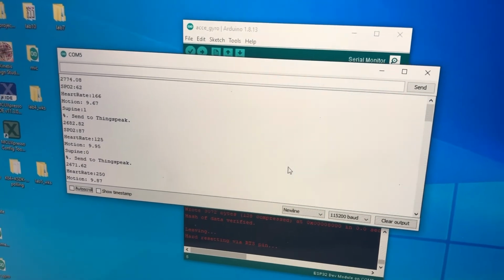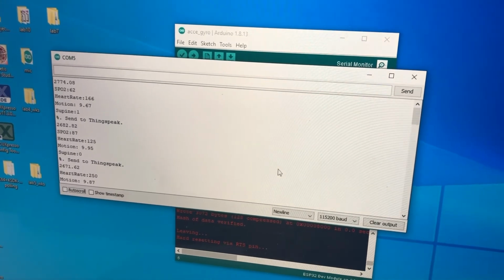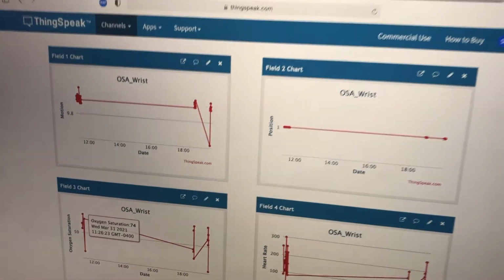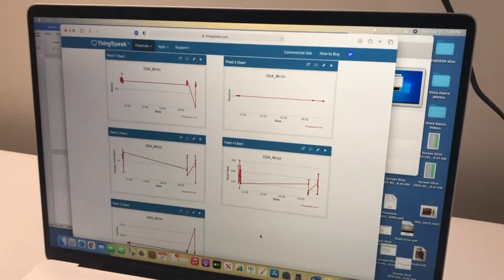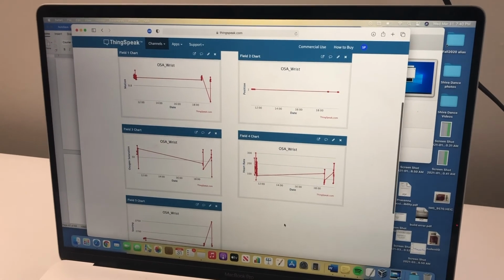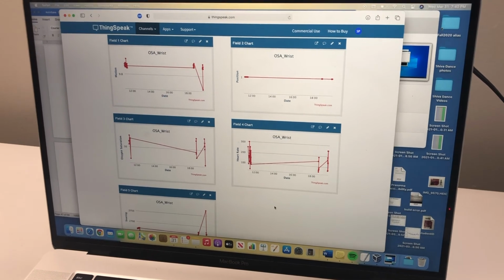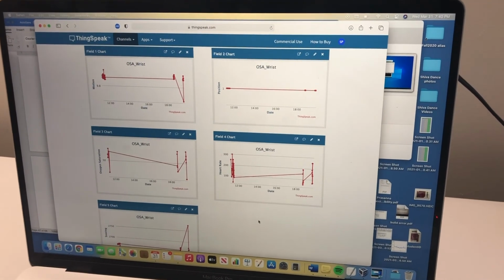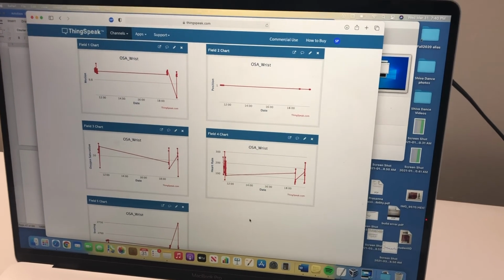And basically all of these values are sent to the ThingSpeak IoT platform, which we can see in this window. And so basically this platform gets data from the Arduino code, and you can log all of the information on a single web page. It's very easy to view and keep track of the timestamps, so we don't need to use a real-time clock on the ESP32.